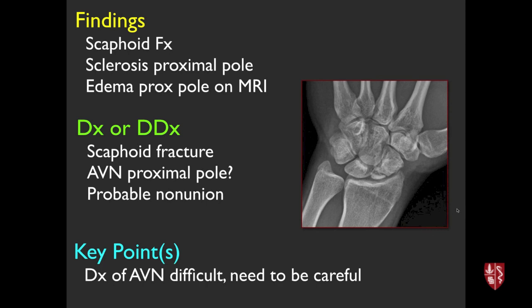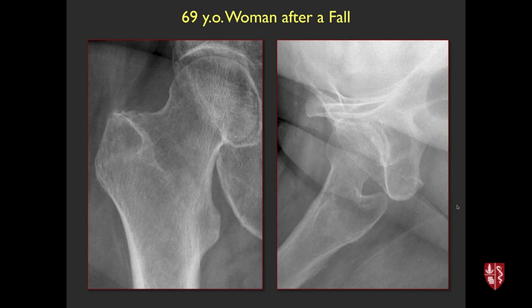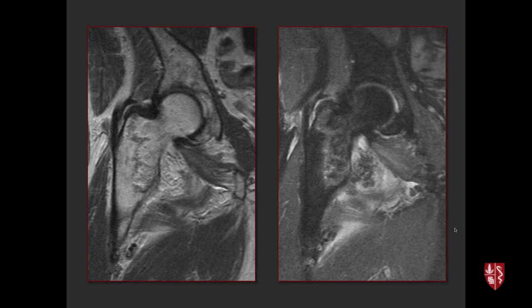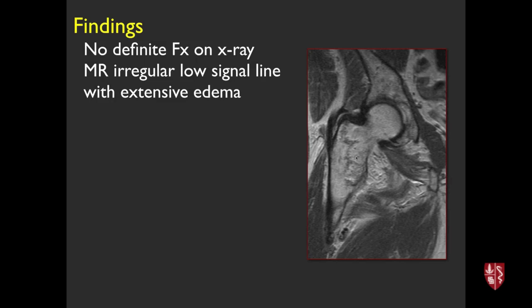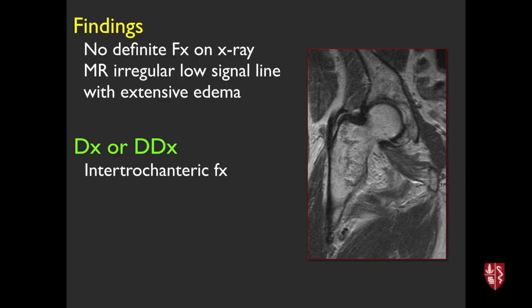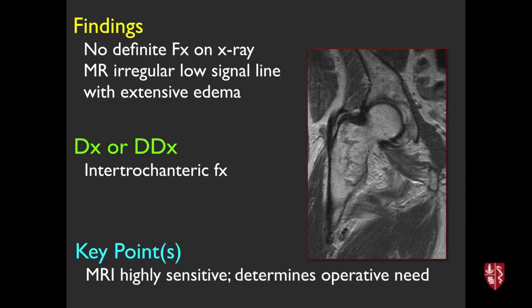69-year-old patient with pain after a fall. X-ray is not obviously abnormal, but MRI shows an irregular low-signal line — an intertrochanteric fracture that's radiographically occult or very subtle. MRI is very sensitive for these even in the fairly acute setting. It helps determine whether the patient needs surgery — whether the fracture goes all the way across the femur or is just isolated to the trochanter.